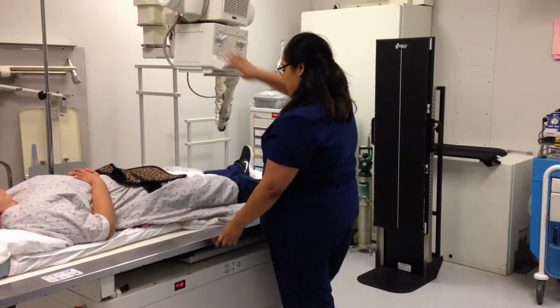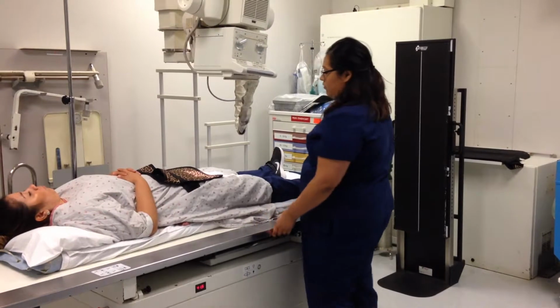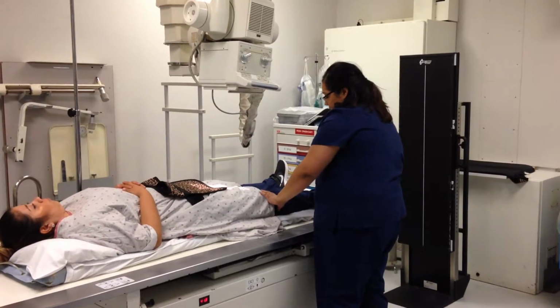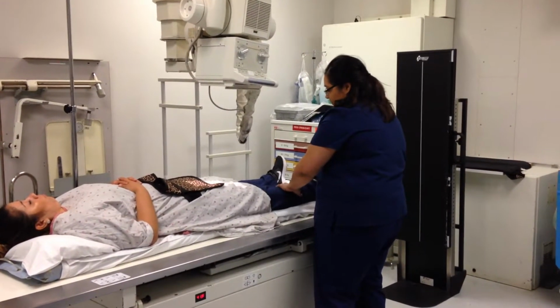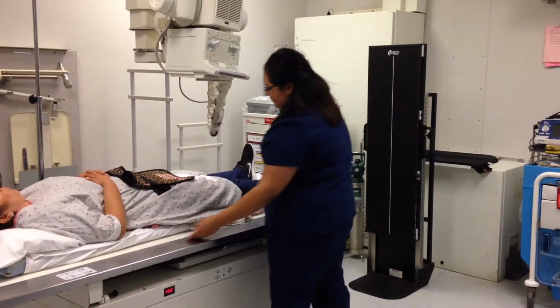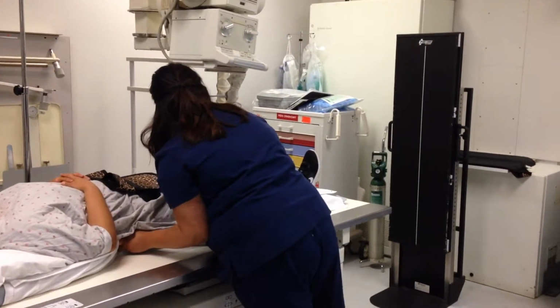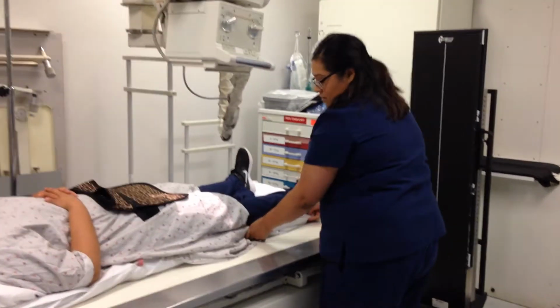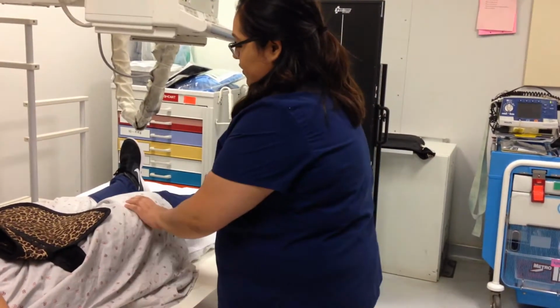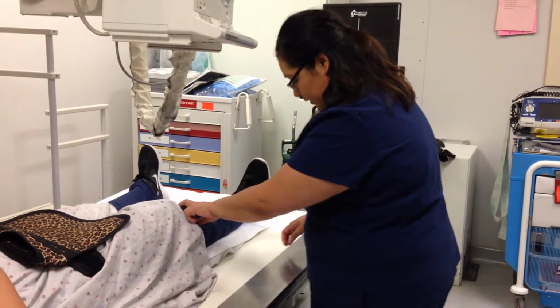And now for the central ray for the AP projection, we want our central ray half an inch below the apex of the patella. And we want the foot nice and straight. Now, I'm going to move your leg, okay? And knee nice and extended, and some room between both knees here. And we can be moving the back just a little bit, okay? We'll bend your knee slightly, and be looking for the patella here, apex, and move just a little bit lower.